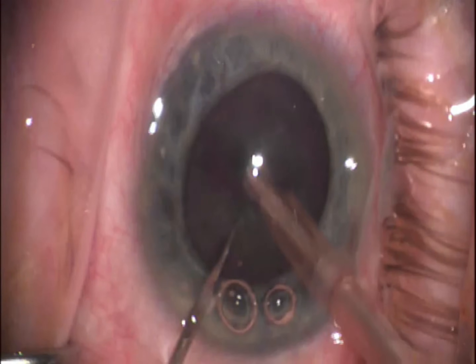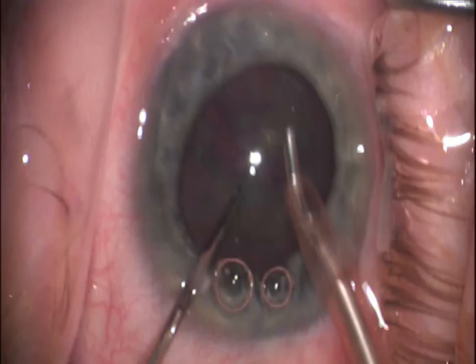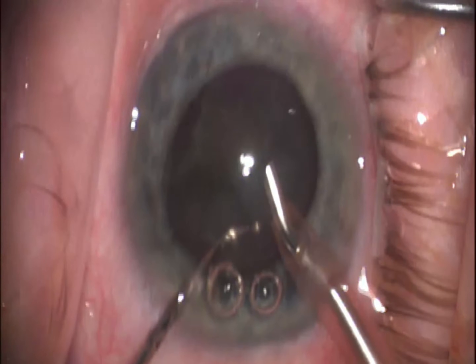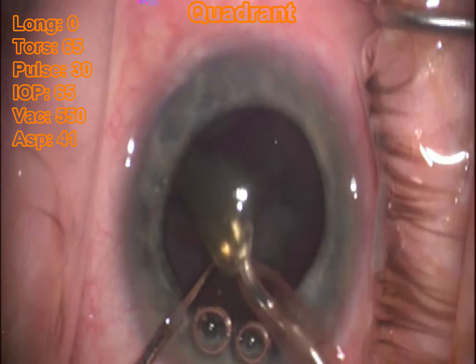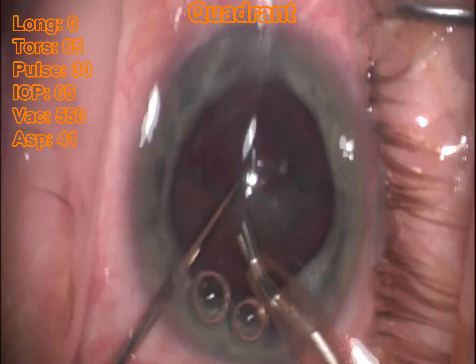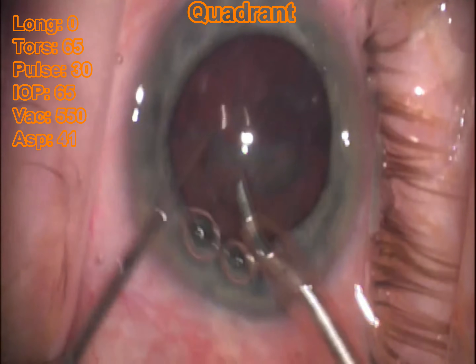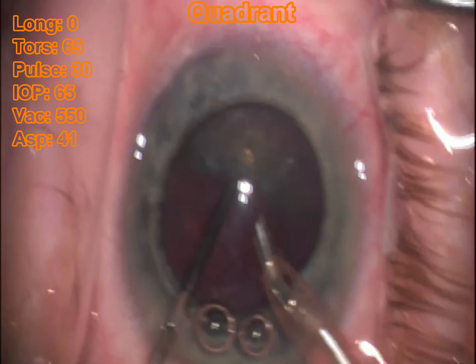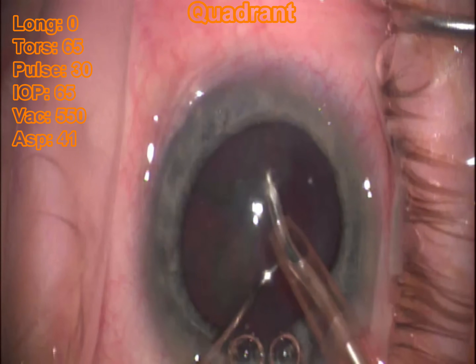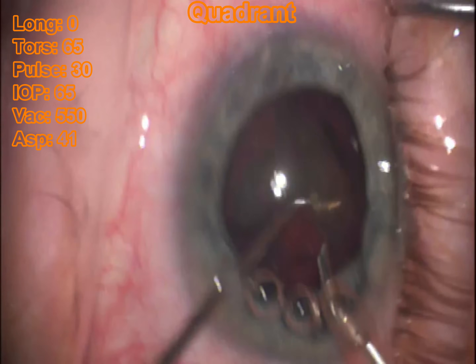There we're cracking that cataract in half. Then I'm going to slip the Connor wand behind the cataract and pull up and against the FACO tip to create an anterior chopping motion. I like doing that because I think it spares the zonules a lot more than a chopping motion where you're pushing down on the lens. I also find that the Connor wand slips nicely in between the lens and the bag, with a very low chance of punching through the posterior capsule and creating a rent. I've actually never had that problem — as long as you're taking your time and being careful, this is an extremely easy and effective technique.